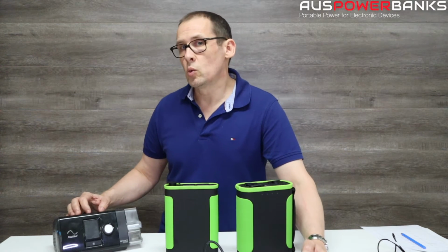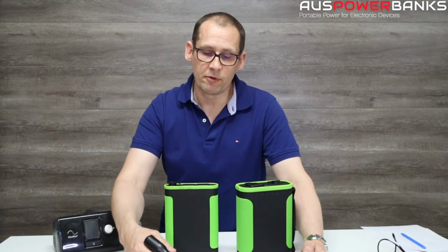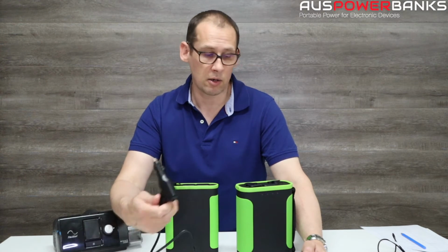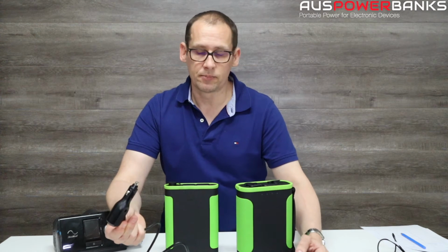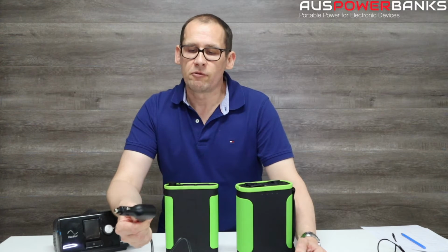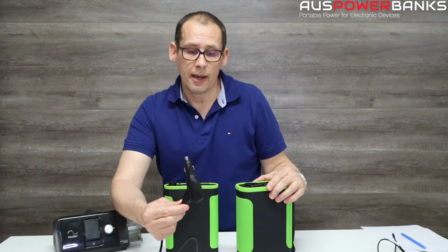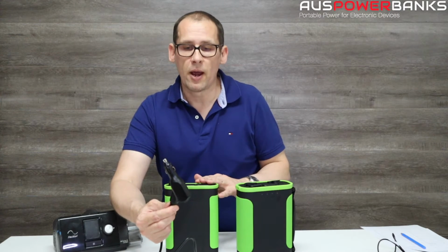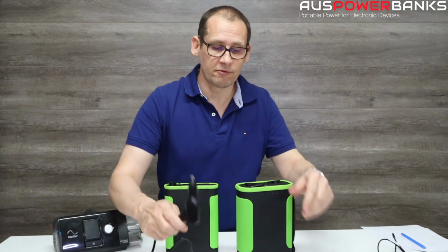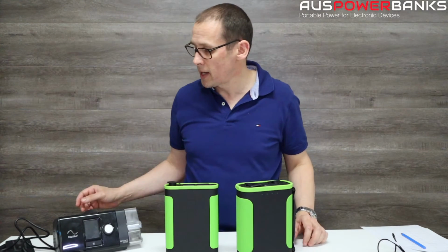This coming out of the wall would normally need 24 volts. So what ResMed offer is a step up for it. It still goes into your standard 12 volt socket in a car or power bank, and it ramps it up to 24 volts. So that's probably the first step if you're looking for a power bank and you want to find out if your CPAP machine is going to be possible to charge from, say, these two power banks. You need to first make sure that you can get a 12 volt charger. That's the first thing, and as I said, most manufacturers will actually supply that.